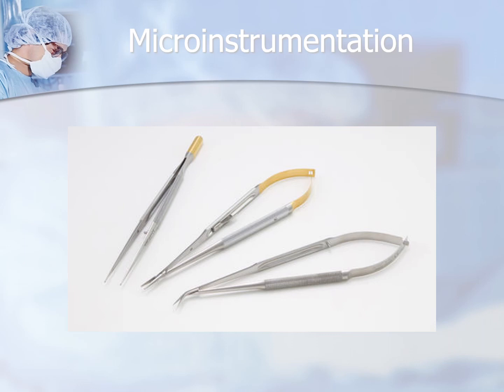And then here's an image of micro instrumentation. You can see the middle one is again the Castro Viejo, but a non-locking one this time, which is a lot more difficult for us because you will still load the needle in the tip here, but then you have to keep it closed as you pass it. So it's a little bit more difficult. And then we have a forceps and a little angled scissor as well.